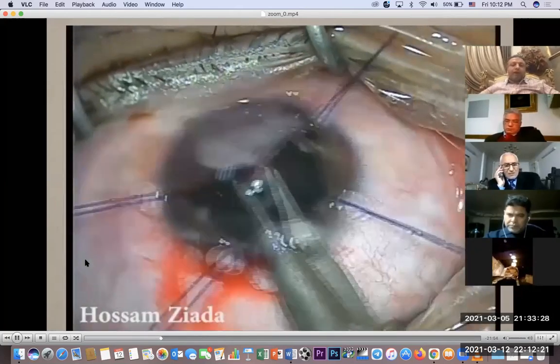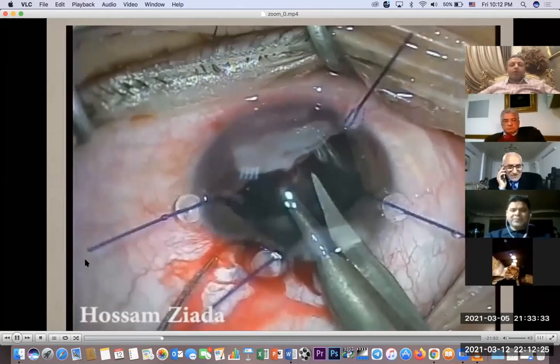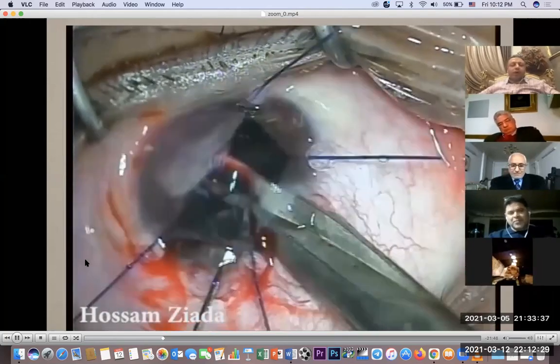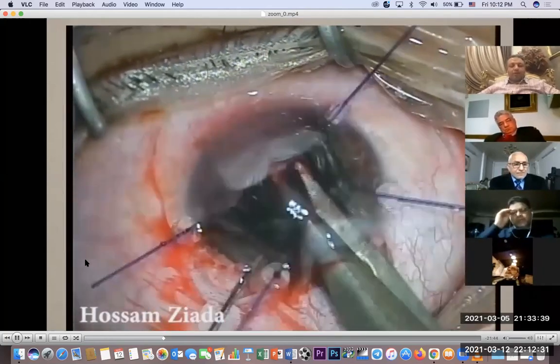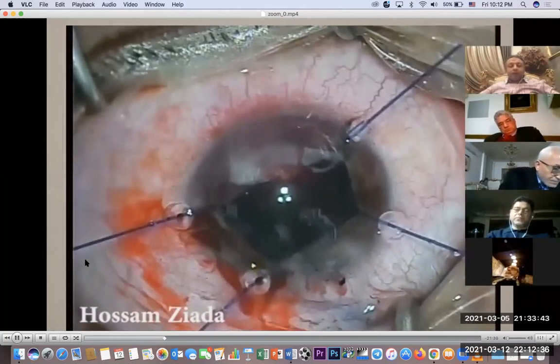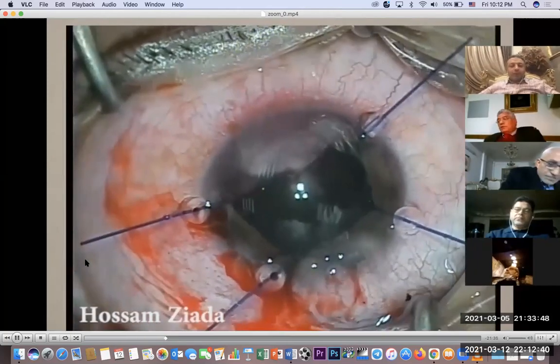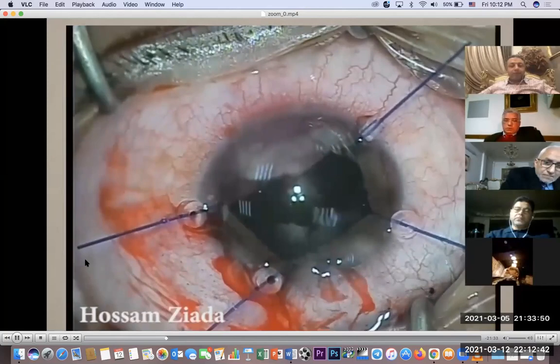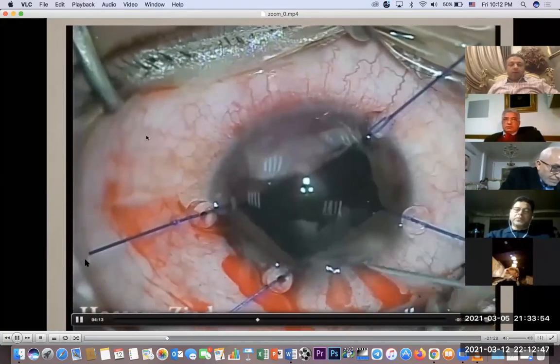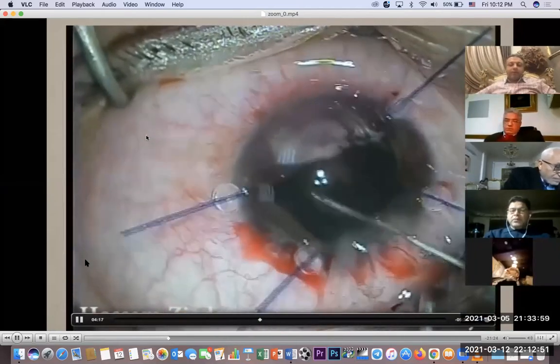So I'm trying now with this big scissor, like a shark going inside the anterior chamber to eat this octopus, but this shark didn't do any job with it. I think I need the white whale or the blue whale to do this job. But I'm trying to think and to store my brain on how to get it.